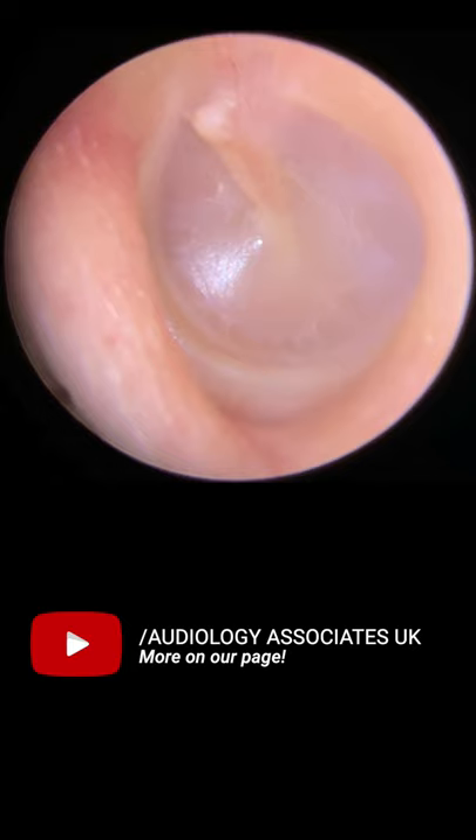As we move around to the seven o'clock position on this eardrum, you can see the light reflex. This is the light we shined into the ear canal that bounces back off the eardrum. That shows me it's sitting in its normal position. As long as it's a triangular or cone shape, that's absolutely fine.